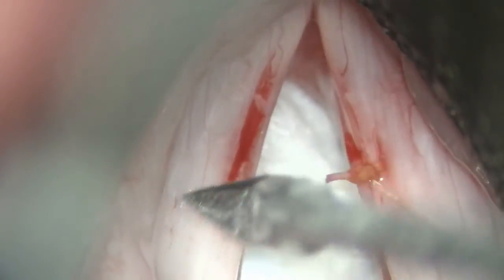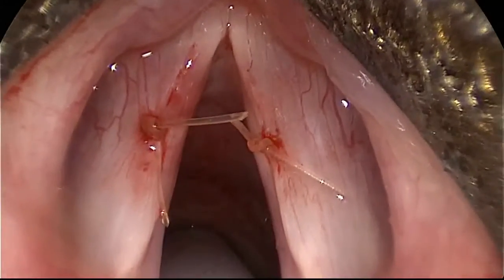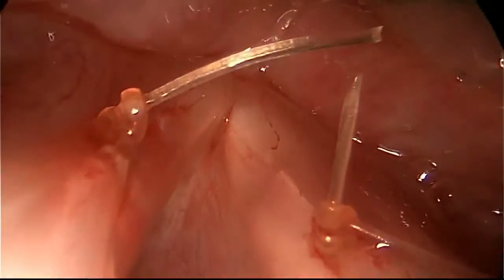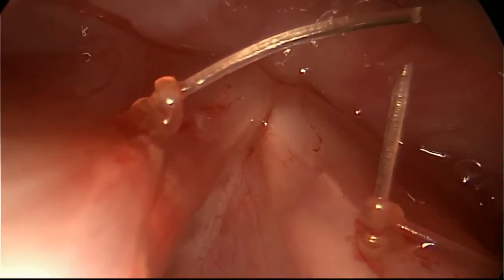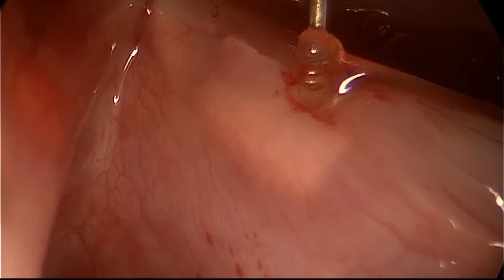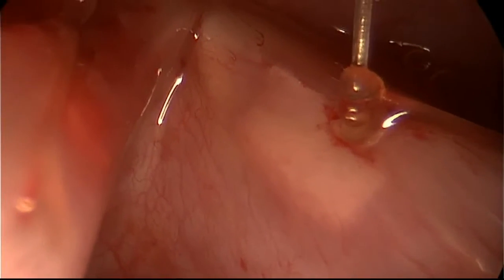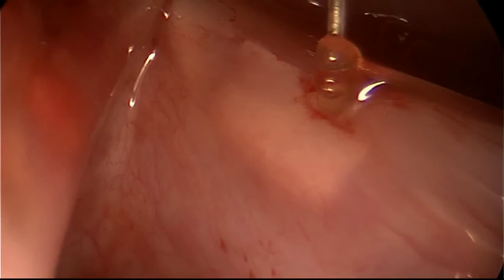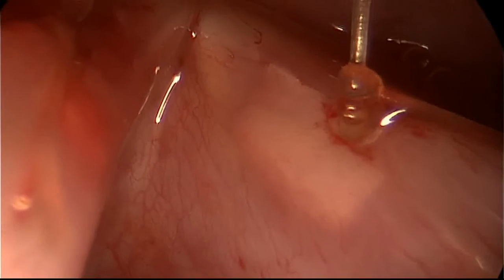In this bilateral case, you will see the temporalis fascia through the epithelium lying flat and covering the area of the entire sulcus without any extrusion. A few drops of fibrin glue or even Dermabond can then be placed on the incision to further secure the fascia in its pocket and prevent extrusion, which would result in a granuloma.